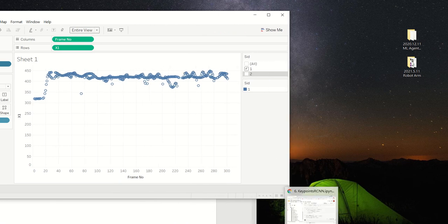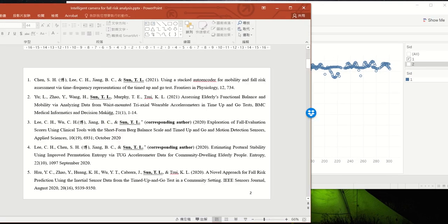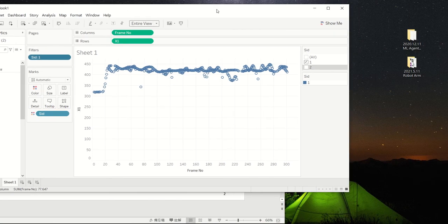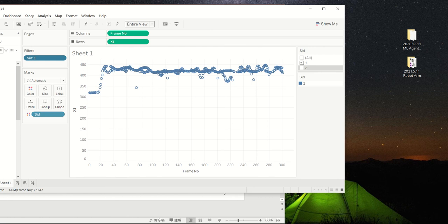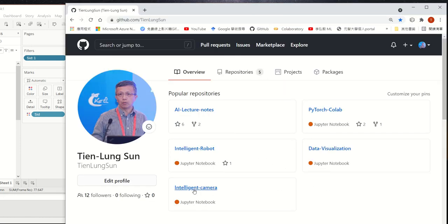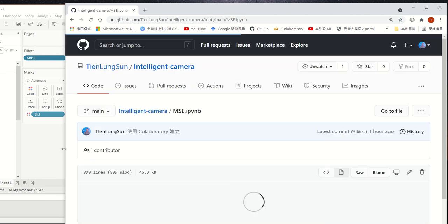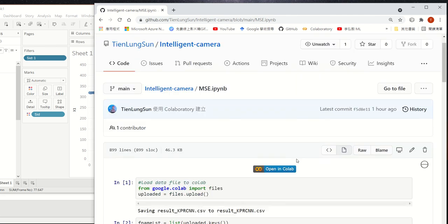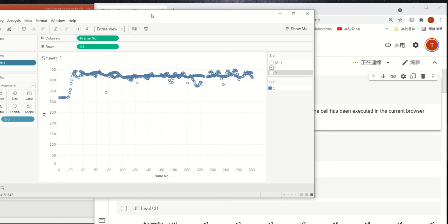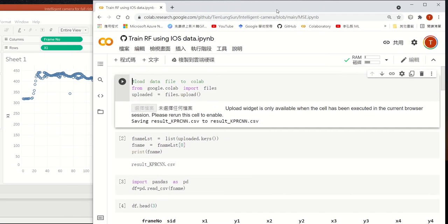Now, if you want to do further analysis, that's done in our paper. For example, calculate the multi-scale entropy, or calculate the time frequency image. You can also go to my GitHub. Similarly, go to this intelligent camera folder and, for example, open this MSE. Now it's very convenient. You just click, then you can open my program in Colab and directly run it.